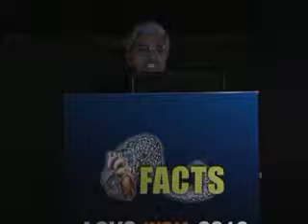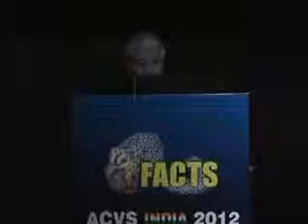In the next case, a 7-year-old girl, there is a left sinus to RA fistula. If you see this, the injection is near into the left sinus. You see the huge fistula which is going behind the aorta and opening into the RA. We had quite a few of these, and with a ductus device, the same technique as we described later, it has been closed.